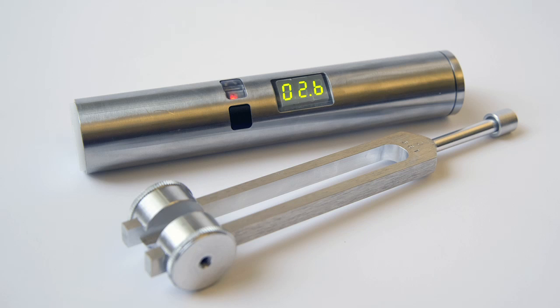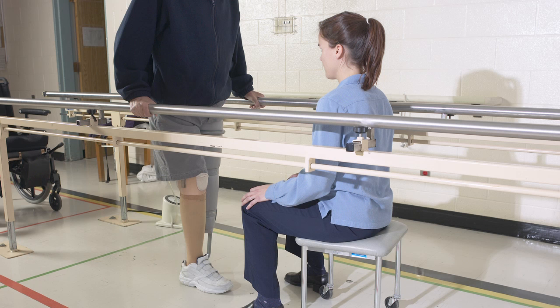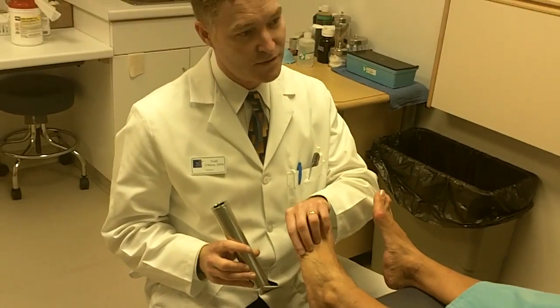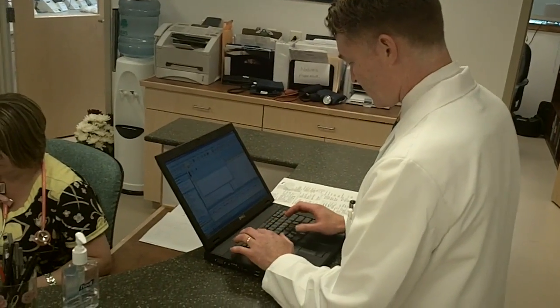The whole thing with diabetics is trying to prevent amputations. About half of all non-traumatic amputations in the United States every year are from diabetics who become infected. The other thing that we're going to evaluate this for is people's balance ability. We know it is decreased as we age, and it's one of the main reasons why people fall. Falls are a very big problem in the United States. I'm envisioning a potential retail kind of home version of this where patients could use the device at home to assess their own sensation.